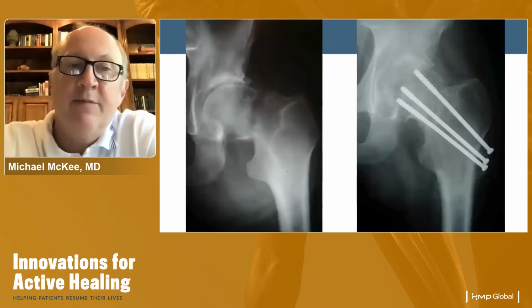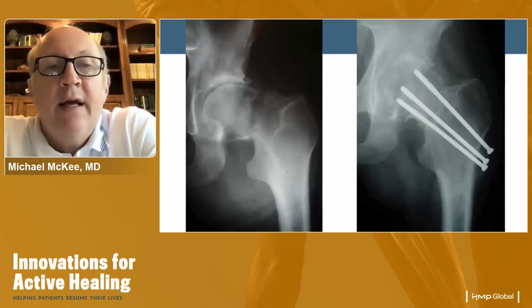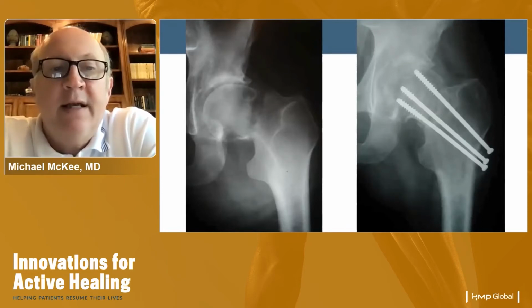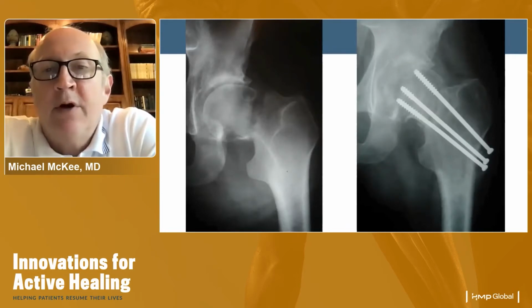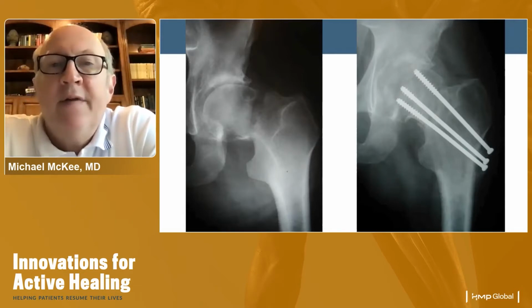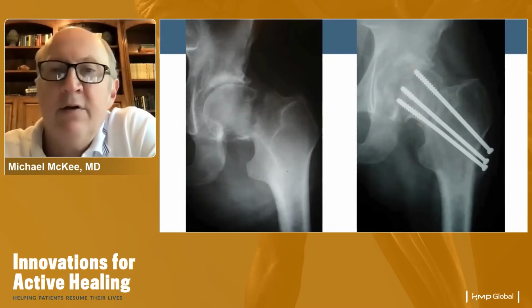This is a patient of mine who had a displaced femoral neck fracture. This was done a few years ago, and he was relatively young, so we felt that fixation was indicated as opposed to a hemiarthroplasty or arthroplasty of some kind. You can see the fixation there, perhaps not ideal compared to today's standards, but not too bad either. Well spread out screws in the head and neck, a very decent reduction, and no varus initially. But you can see already here that this patient has started to develop a non-union with backing out of the screws and failure to heal at the fracture site.